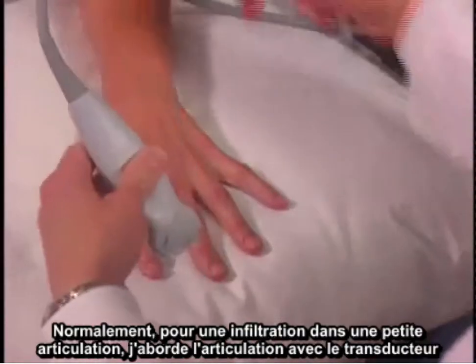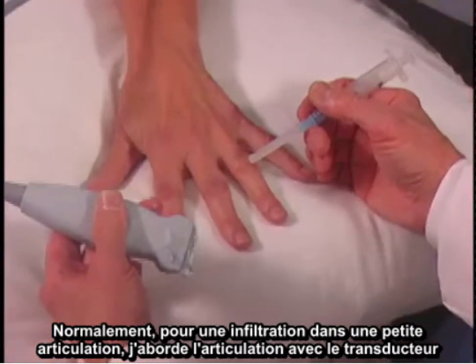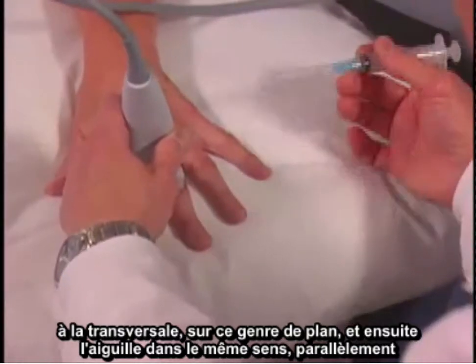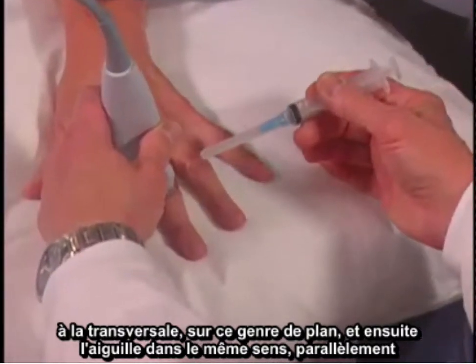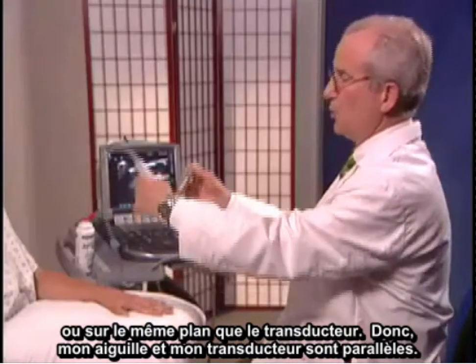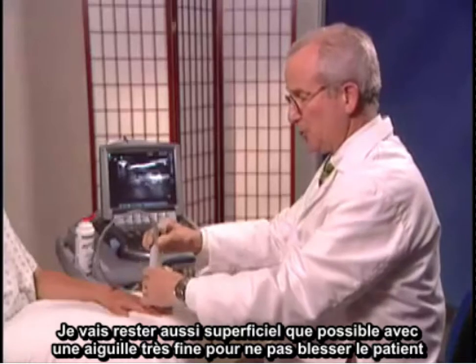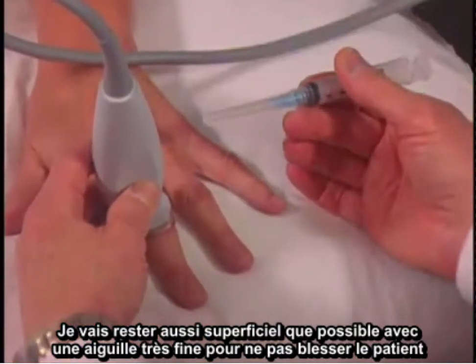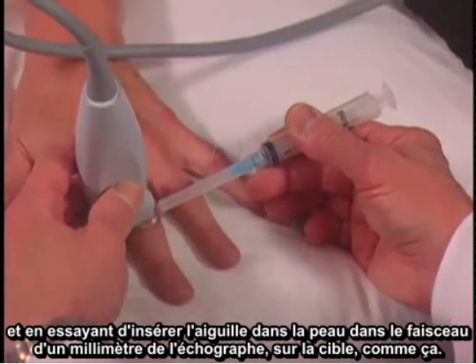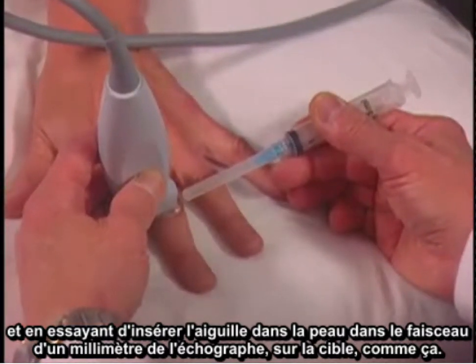Normally for an injection into a small joint like this, I like to approach the joint with the transducer placed transversely in this type of a plane, and then have the needle in the same direction parallel or in-plane with the transducer. I'm going as superficial as possible with a very small needle so it doesn't hurt, and trying to place the needle into the skin and in the one millimeter ultrasound beam into the target this way.